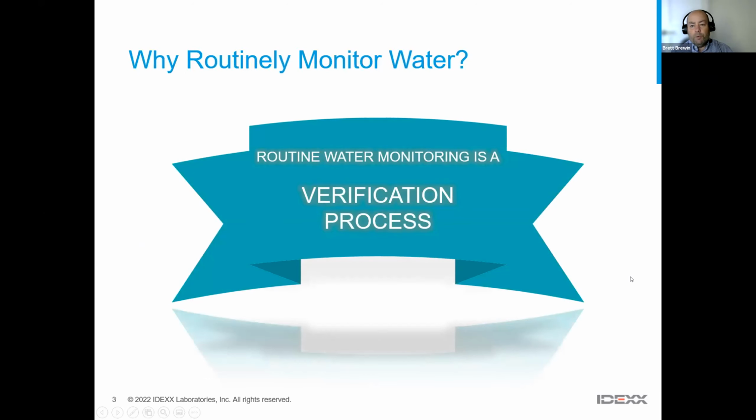So routine water monitoring is really a verification process. We want to verify that the processes that we have in place between taking our source water through the treatment process to producing a product that's suitable for drinking, we want to verify that those processes are working correctly.